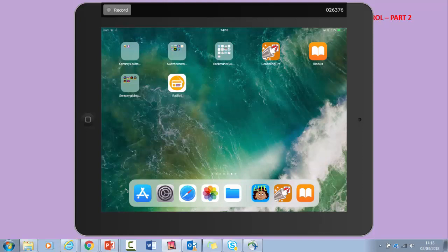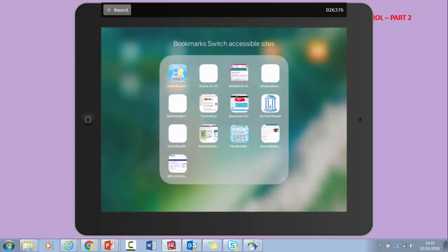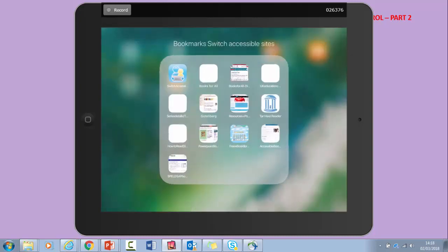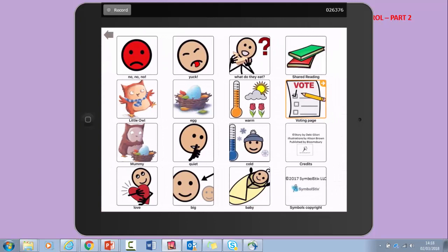So hopefully you found this useful. Simply Bluetoothing the applicator to the iPad using one switch and making use of apps which already have inbuilt switch control, or downloading books and then uploading them to iBooks and pressing the switch to turn the pages, or from the sites, downloading some files which are already Sounding Board files and using the switch to work through the symbols.